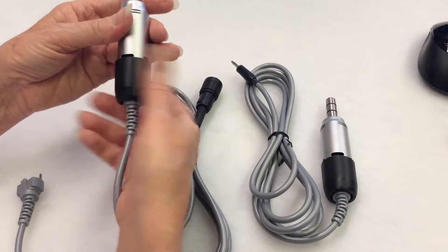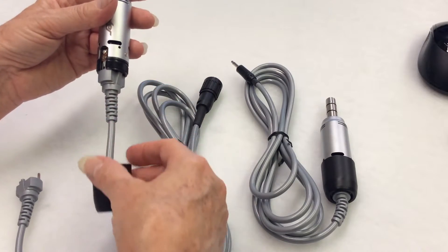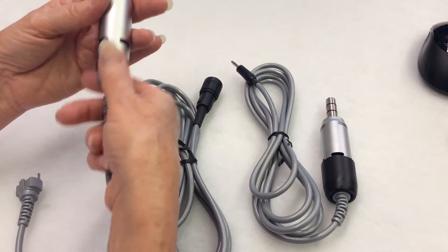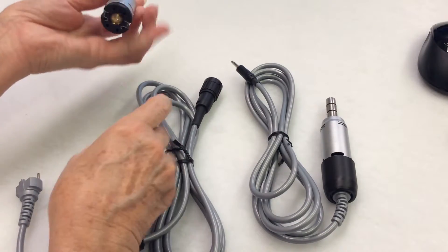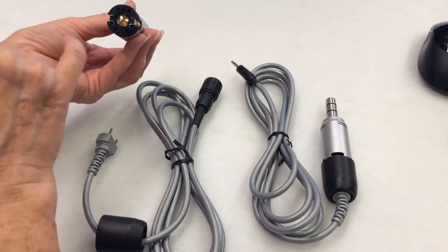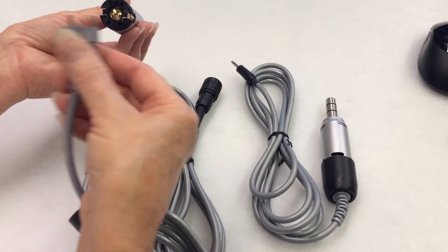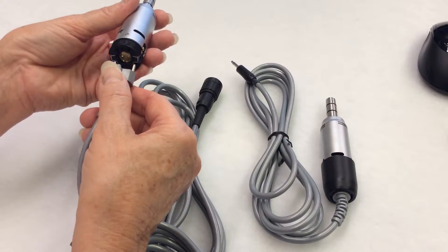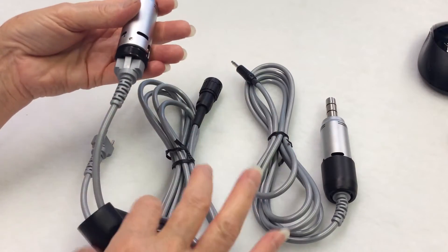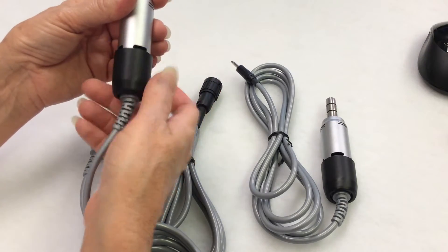Remove the bottom cover of your micromotor by unscrewing it counterclockwise until it slides down the cord. This quick connector pulls out completely. See the two metal clips? There is a hole here and here. Take the new replacement cord, push the connector into the micromotor all the way, slide the cover up, and screw the bottom cover on clockwise.